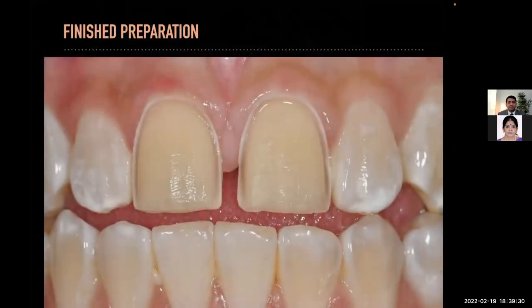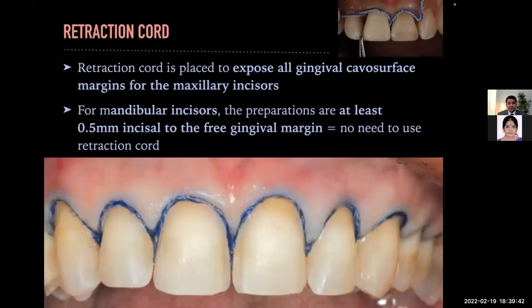These are what the finished preps look like. Remember, your margin should never be finished on an existing composite restoration. When you are done with prep, retraction cord is placed to expose all gingival cavosurface margins for maxillary incisors. For mandibular incisors, the preparation is at least 0.5 mm incisal to the free gingival margin, and you don't need to use retraction cord.